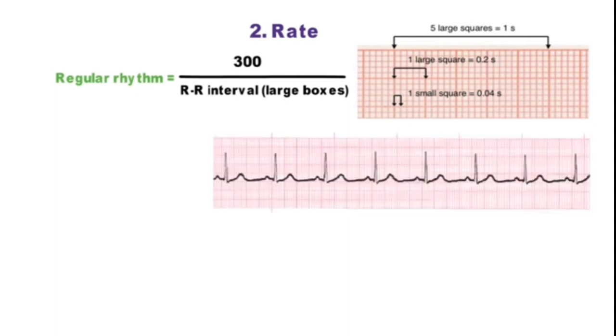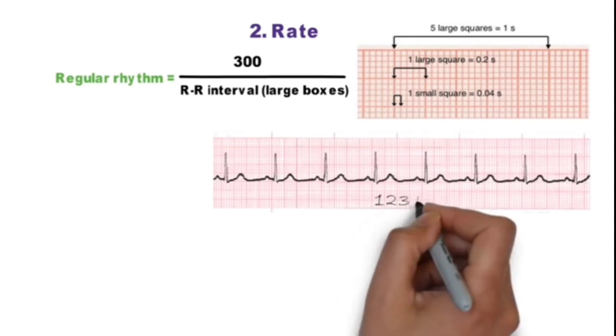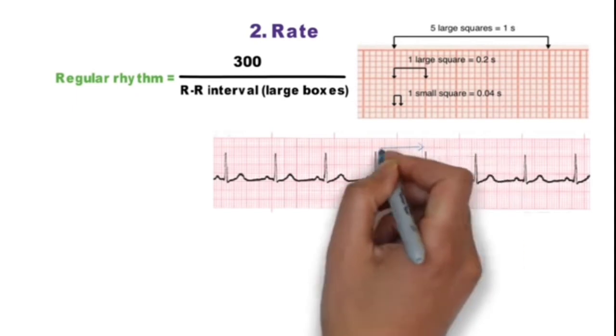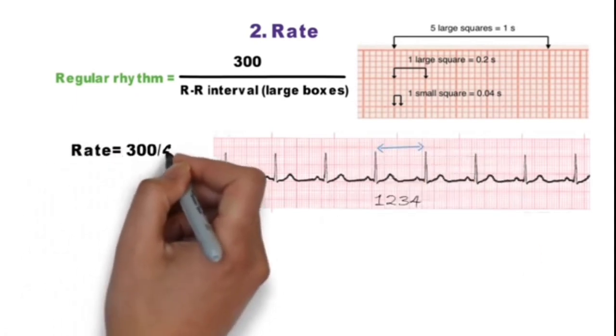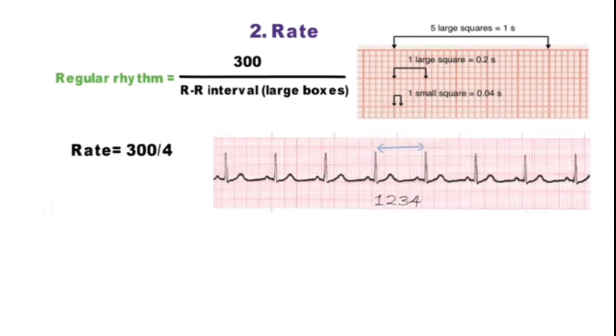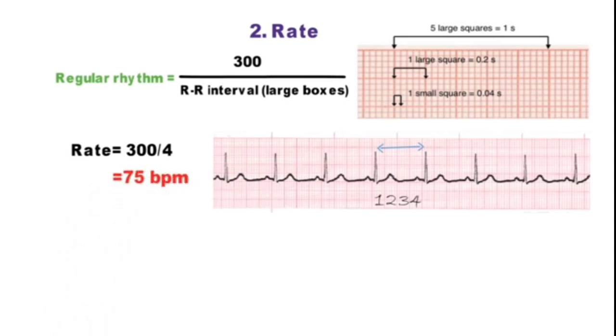This is a normal sinus rhythm ECG. There are 4 large boxes between RR interval, so if we divide 300 by 4, heart rate will come 75 beats per minute.